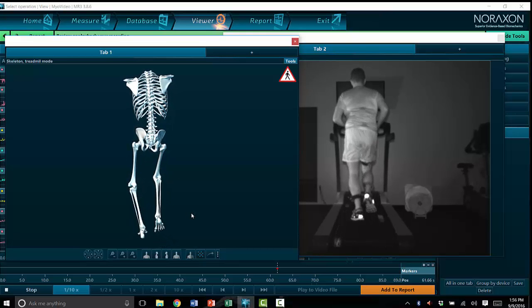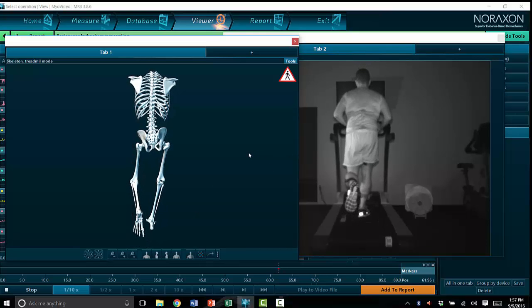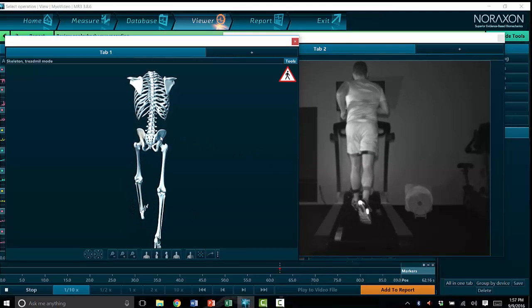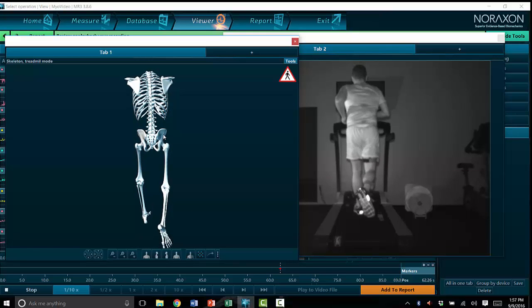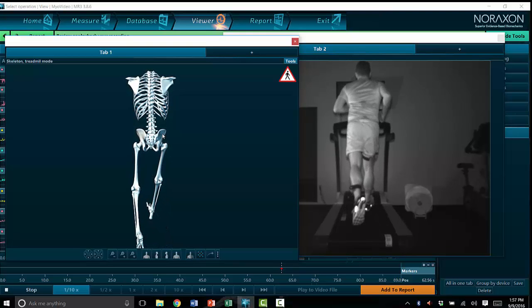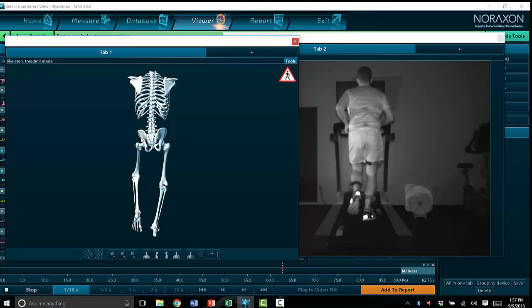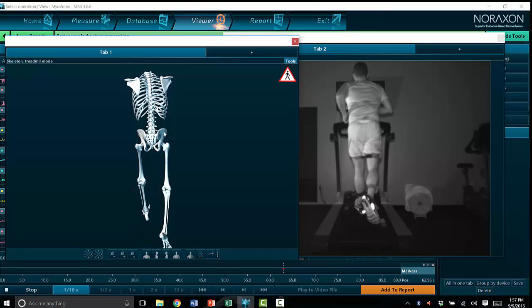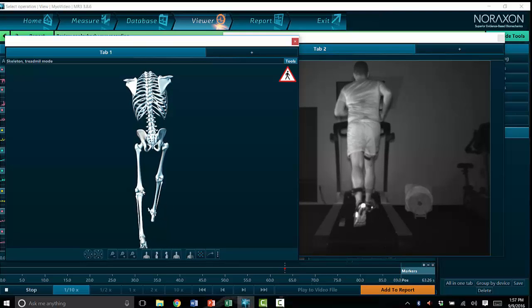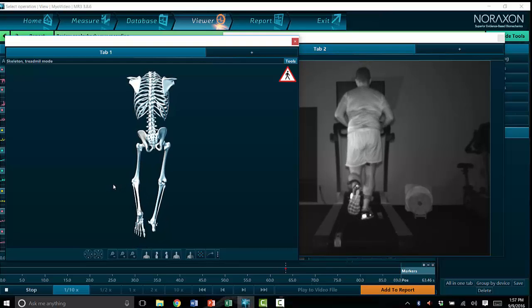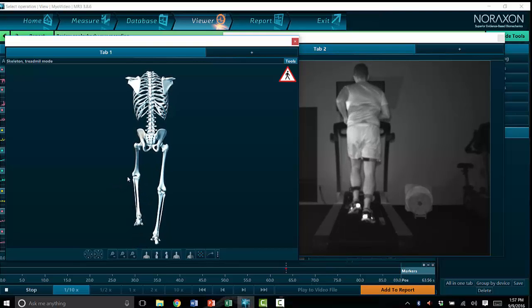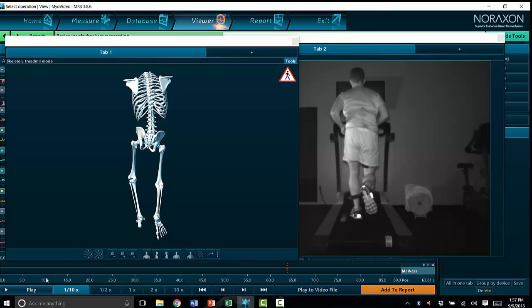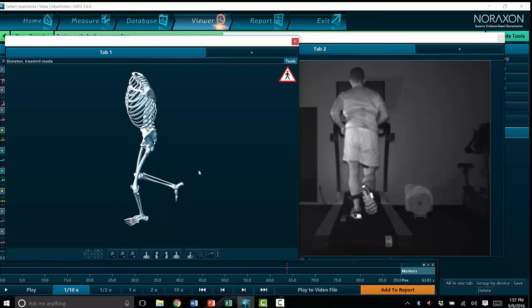And what you catch initially from the skeleton more than you do the video, is you see there's a contralateral pelvic drop right here, significantly more than when the weight bearing is on the right side. And then you also see some genuvarus - you see the knee bow out to the side on the left side more than you do the right side. In the video we can clearly see the pelvic drop, but what we can't clearly see is the genuvarus. But we do see it here based on the 3D motion data.